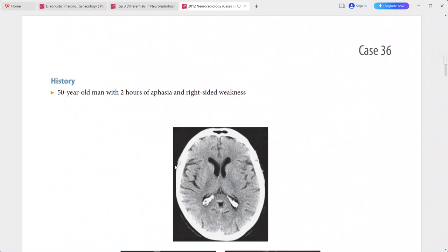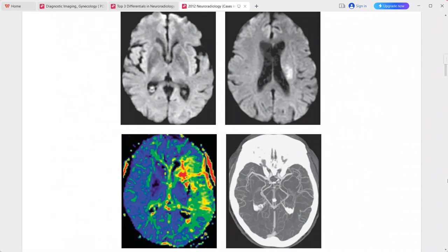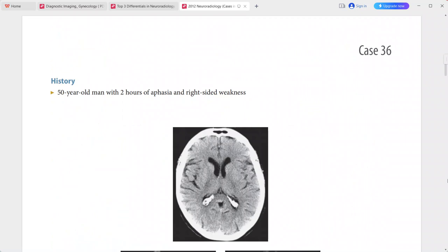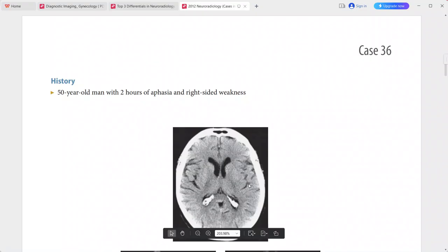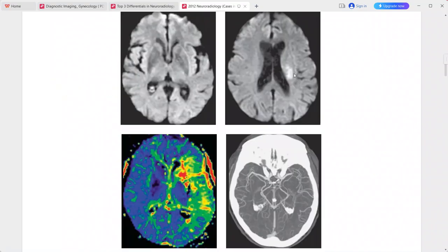Next: a 50-year-old man presenting with two hours of aphasia and right-sided weakness. Non-contrast CT shows no evidence of infarction, hemorrhage, or mass. On DWI there is a small area of restricted diffusion in the left corona radiata and putamen.